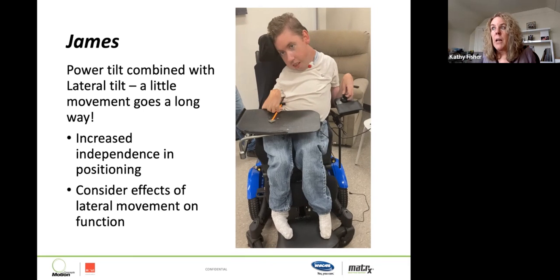The other thing is he might move even just a millimeter, and that will change his relationship with the joystick. As you can see, he uses a micro extremity joystick with his hand in that very flexed position. He doesn't have any range in that arm. And then he uses his right hand, he uses that stylus to access his phone.